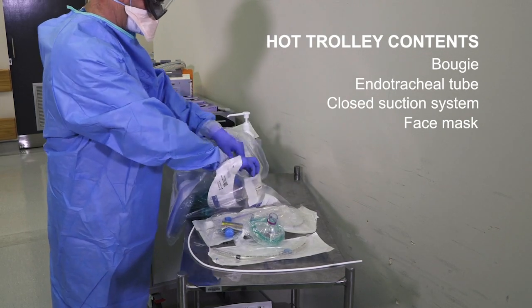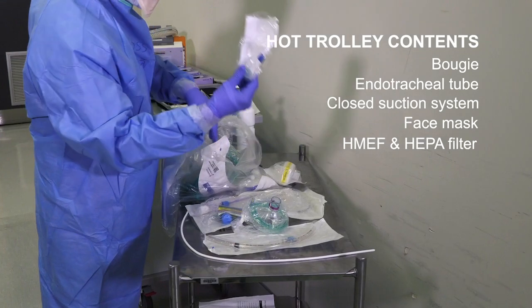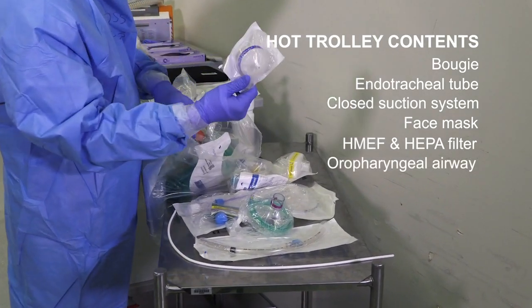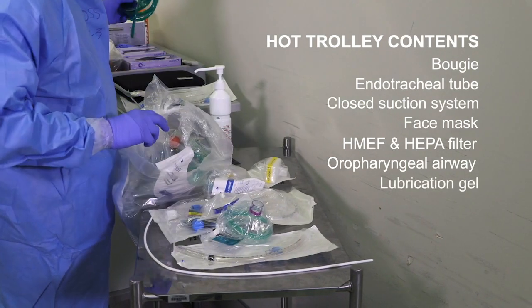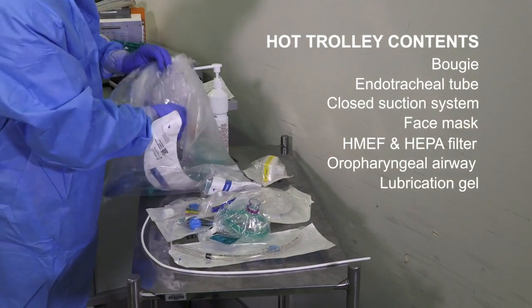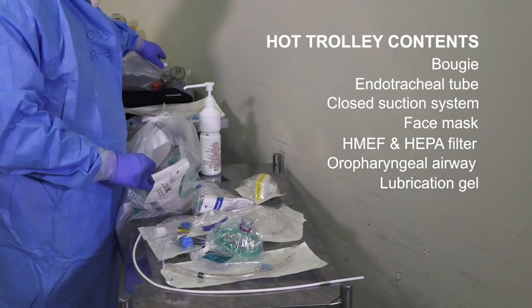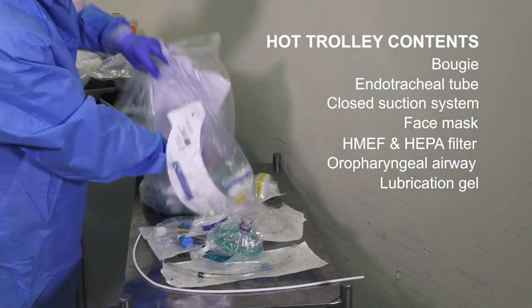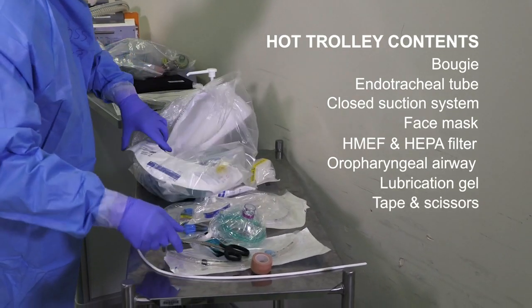A spare tube stays outside. A HEPA filter and OPA airway are all on the hot trolley. A viral filter on the hot trolley. Some lubrication gel. Spare oxygen tubing stays outside. The ambi-bag is spare and stays outside. Some tape to secure the tube and a pair of scissors — all on the hot trolley.